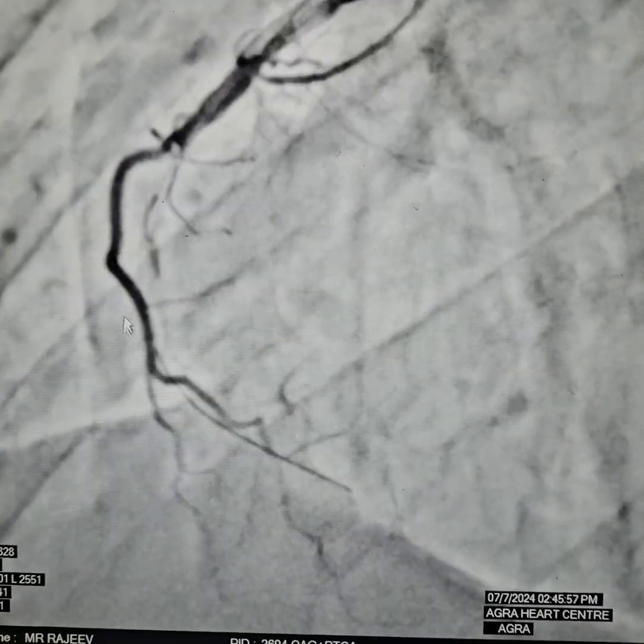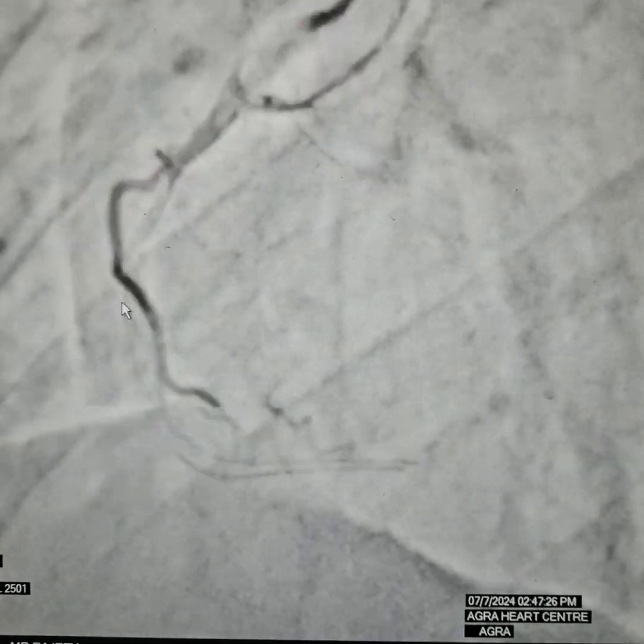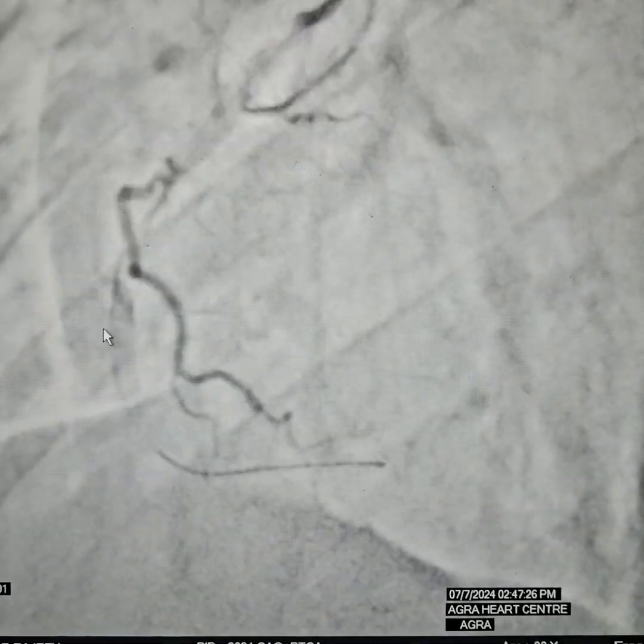You can see this is a 1.5 mm balloon. Whenever you are doing a large 100% occlusion case, try to take a small balloon. Because if you are not in the artery and you take a large diameter balloon and you inflate it, then there might be problems — you can end up in a huge pericardial tamponade very quickly. We can see that the border started to become evident. We are only dottering here at this point. Once we have estimated that we are in the correct artery, as you can see, it has a large, huge, organized thrombus burden. Even though the patient was on Clexane after he came to us, sometimes antiplatelets are not enough and you get a very huge, organized thrombus burden and it is very hard.